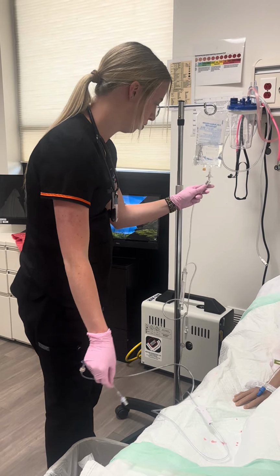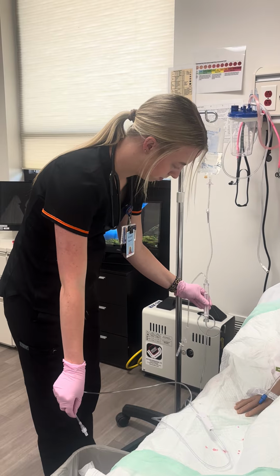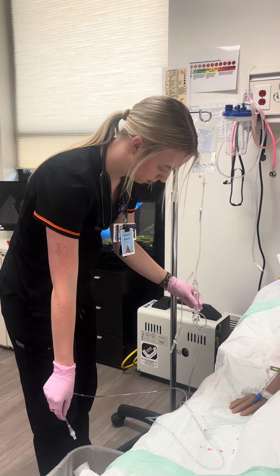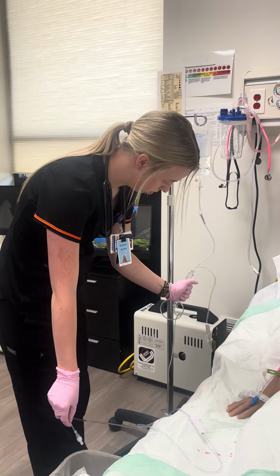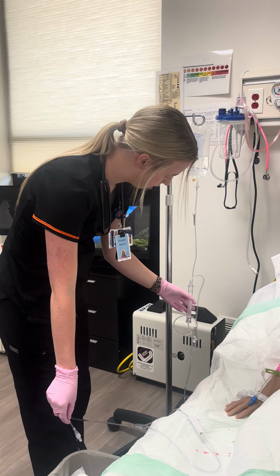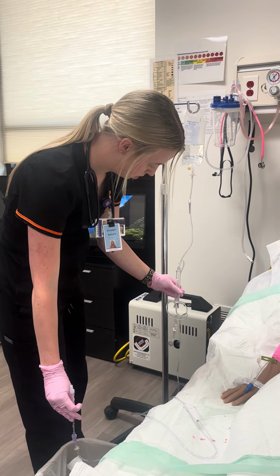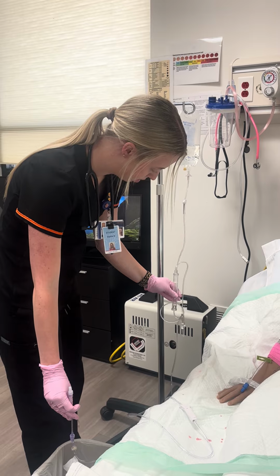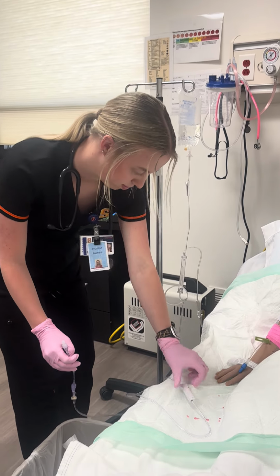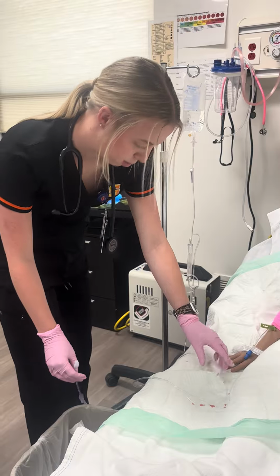And we're going to unclamp this and fill up to run through. Okay, this part takes forever and I don't know why. It wants to take extra long today. You know what, for sake of not losing every ounce of fluids, we're going to clamp this part off too.